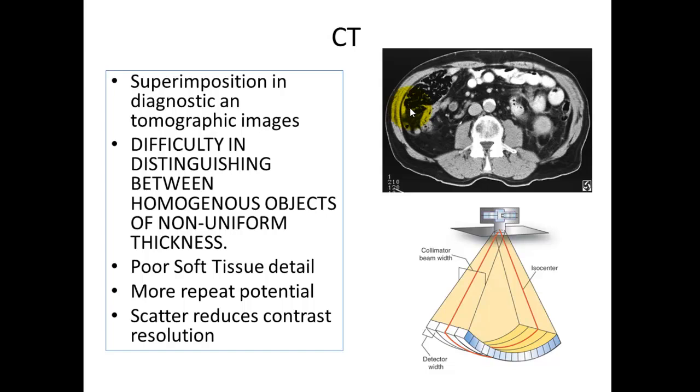Essentially, it disappears, or the grayscale that is attributed to 2 different objects remains the same, and you can't tell the 2 from each other. So we get rid of a lot of the superimposition. We get rid of structures that are lying on top of each other, and we are able to isolate a cut or thin slice of the anatomy.